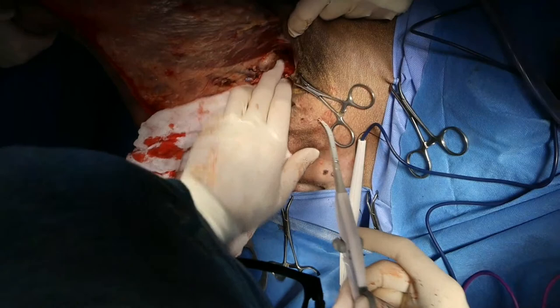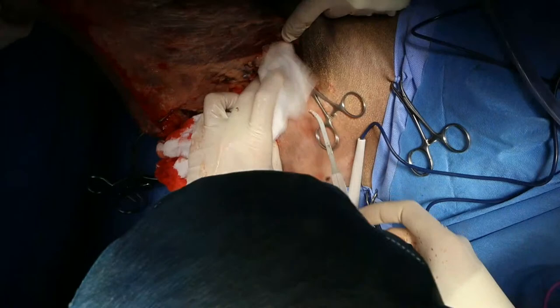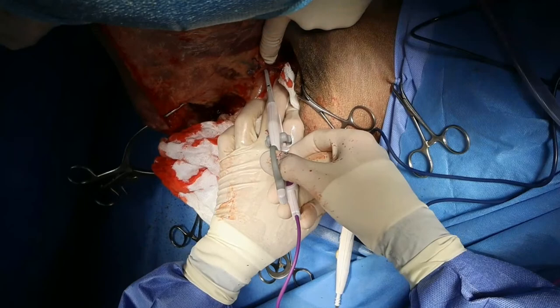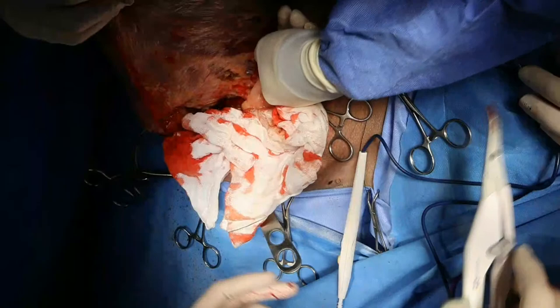So now I've got some... Snap, crackle, pop. All right, so I've got a little bit of bleeding up here. So, that's femoral nerve right there. That's the medial aspect of the ilial wing. So stick your finger in there. So we've just come around the medial aspect of the ilial wing. And that's where the iliolumbar vessel is going to be.